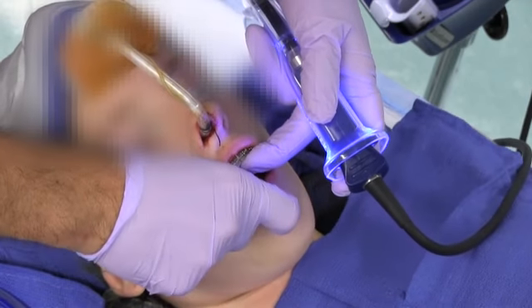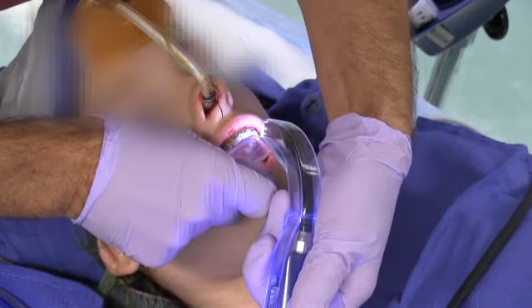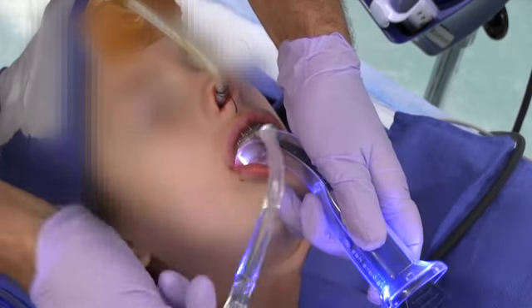The larynx is now visualized, preferably with a video laryngoscope. There is blood noted to be pooling in the hypopharynx, and this will be carefully removed.